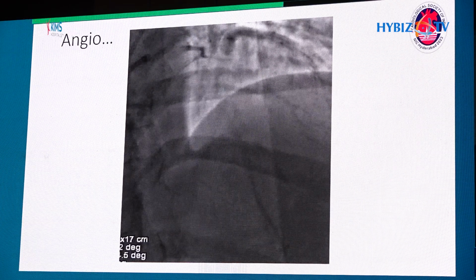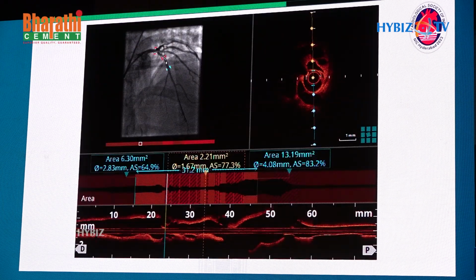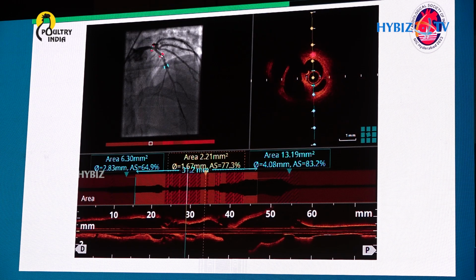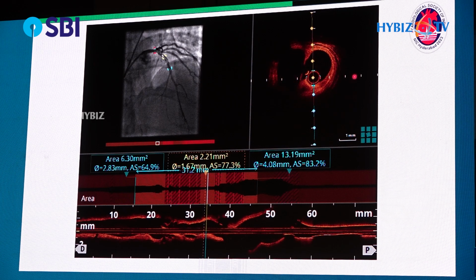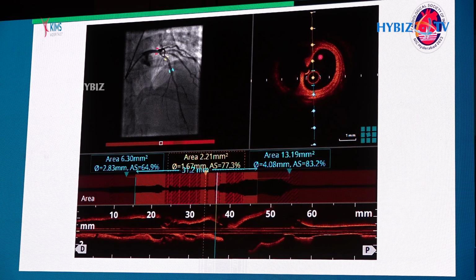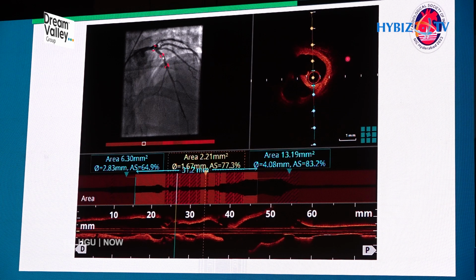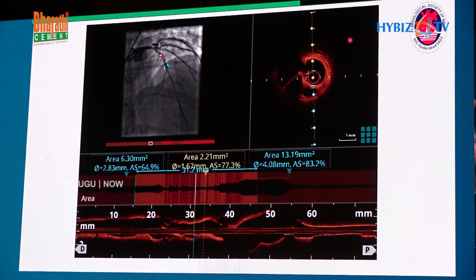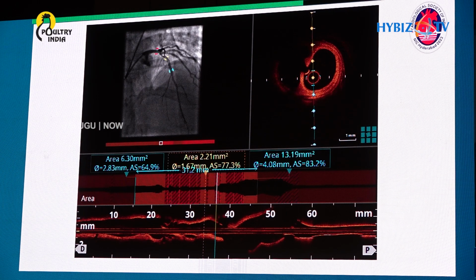And again, look at these angiogram pictures. There are intraluminal defects. So it is a recanalized thrombus. The difference between a SCAD and a recanalized thrombus: a recanalized thrombus is limited to the lumen. There is no break in the intima and there is no involvement of the media. But in the SCAD, it's predominantly a layer between the intima and the media which gets involved. And here you get a lotus root appearance with multiple channels.